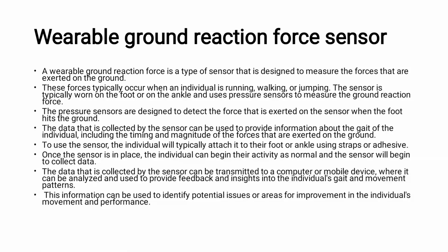This is very much useful in analyzing the walking pattern of a patient.